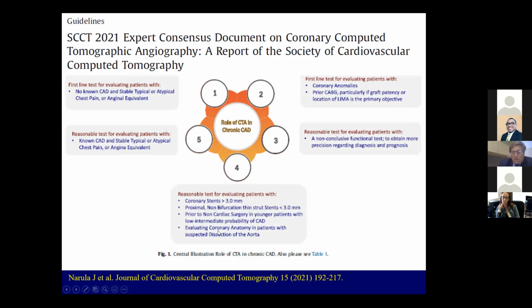Again, when you have a patient who is going to be at high risk for a coronary arteriogram, the patient who's dissected their aorta and their angiogram would be much higher risk, and you want to rush them off very quickly to the operating room, CT angiography would also be a reasonable test to consider.